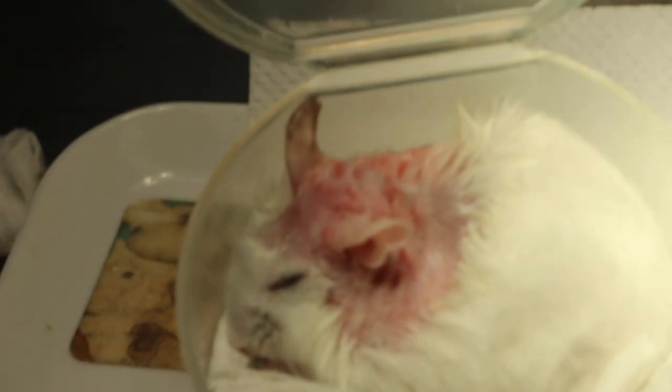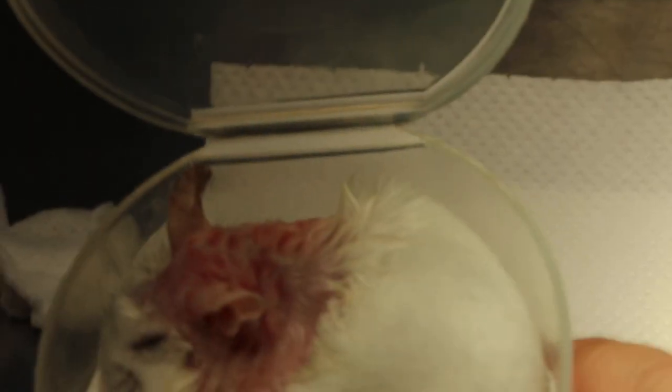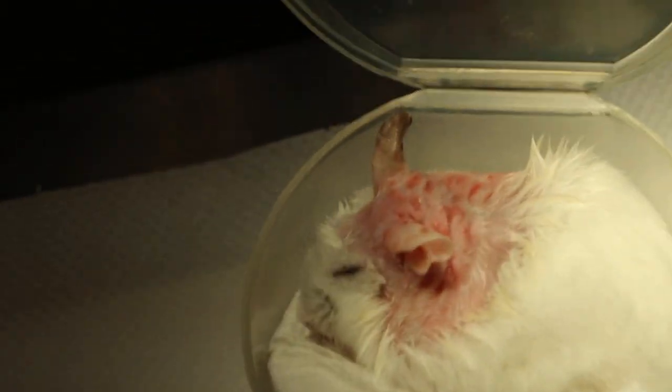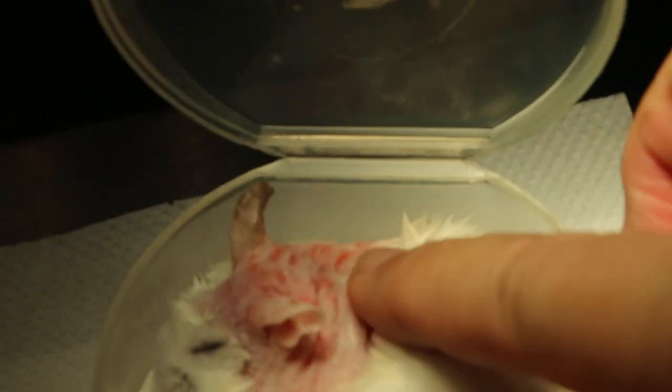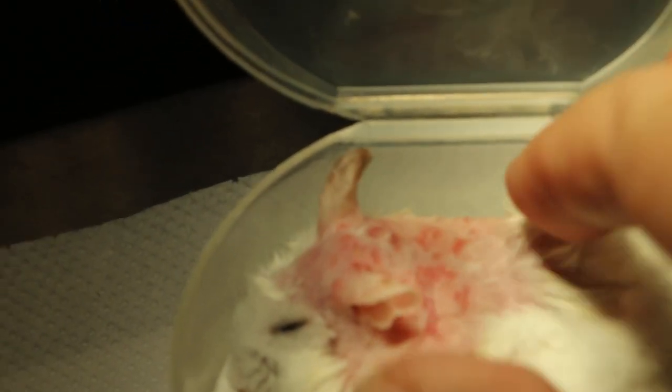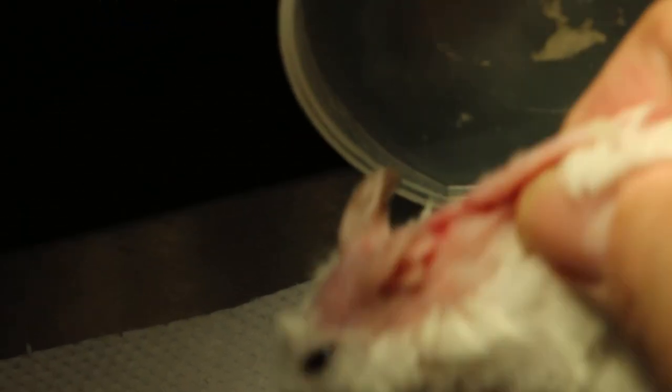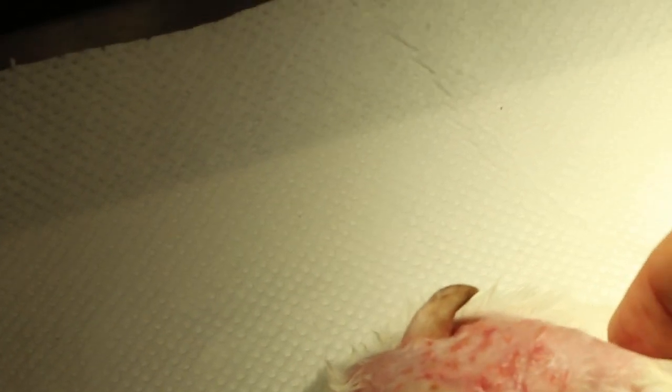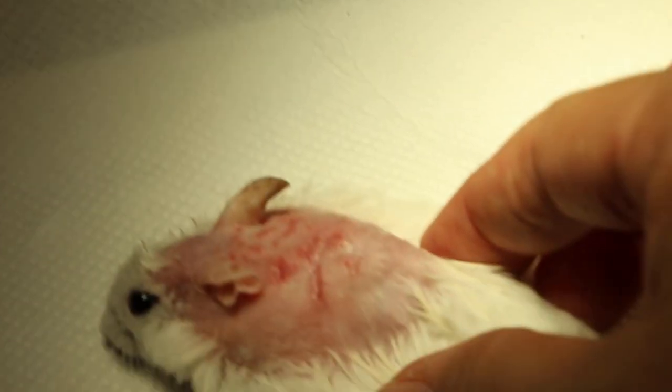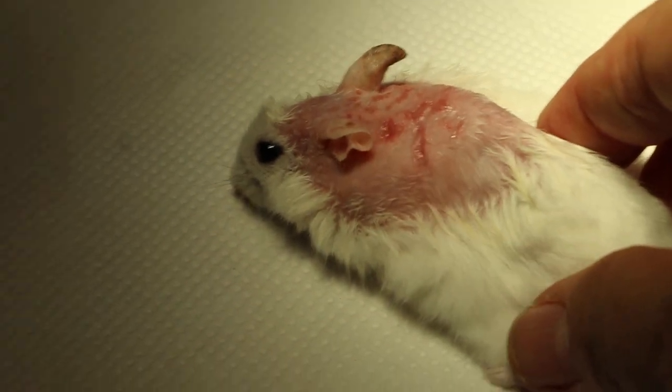It's down already. At 5% you have to be quite careful. You can see the scratch wounds, that's pretty bad, the scratch wounds. Now it's awake already.